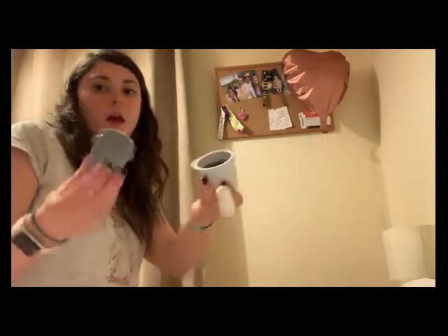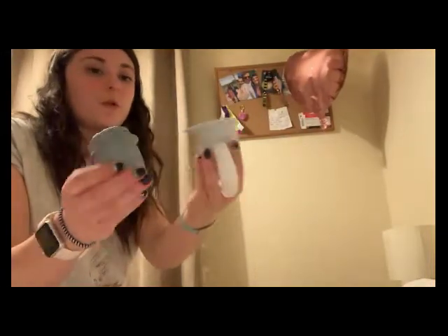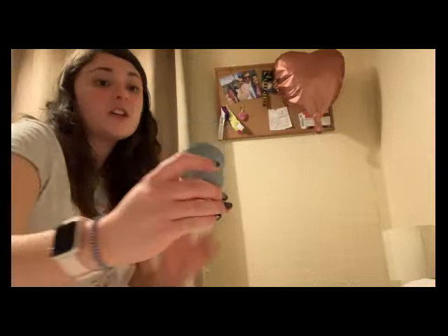But for those people that are reviewing this video for that, I have done other videos about it if you want to watch them. They can go in the normal bin, they're fine. The needle gets shoved right inside there and you can't even get to it, so it's safe to go in a bin.